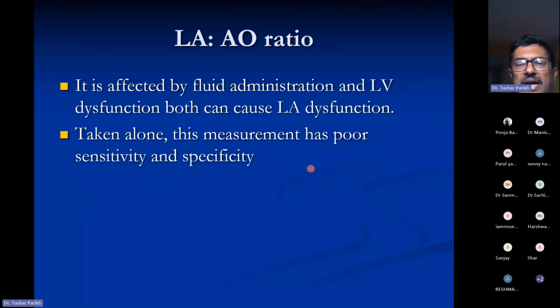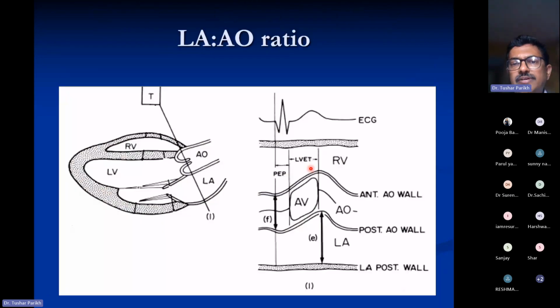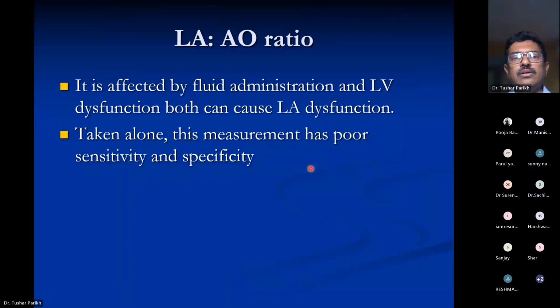So this ratio again, if it is more than 1.5, it is significant. More than 2 is definitely significant. But LA/Ao ratio is affected by fluid administration, and taken alone is not a very sensitive or specific indicator.